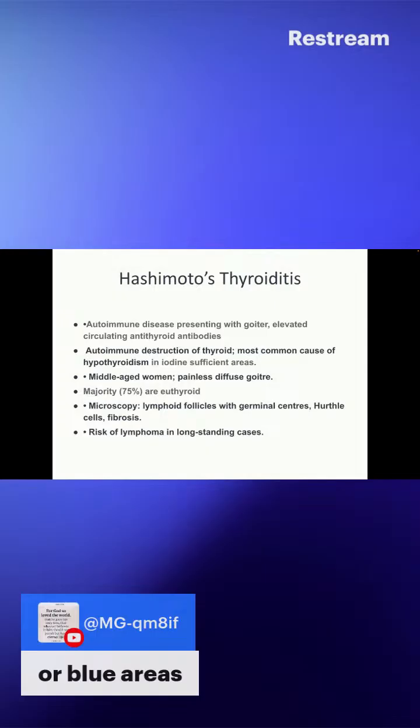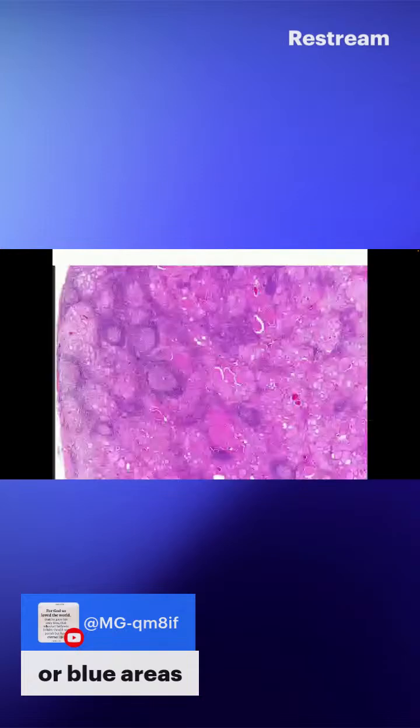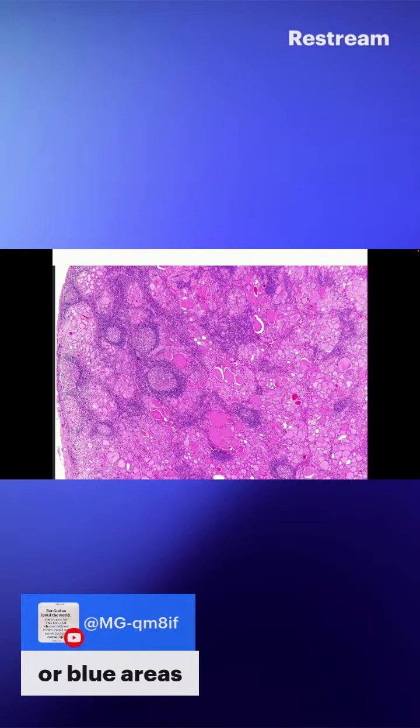But because of this process, the thyroid is really inflamed and it's just trying to fight itself. This results in forming this kind of reaction, which is a plasmacytic reaction. And even this inflammation can be very distinct, so that it can produce a germinal center, like you can see in a proper lymph node. And they start eating up or destroying these follicles.